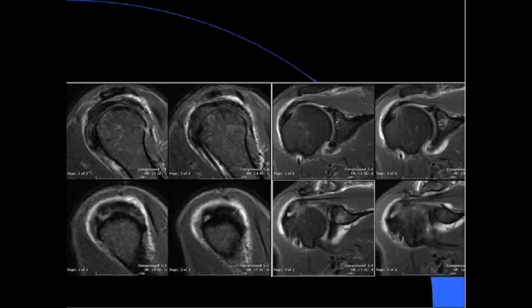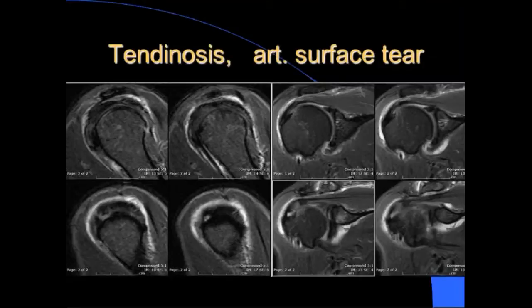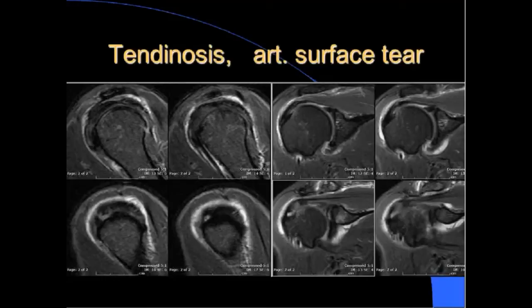Intermediate signal in the supraspinatus tells you it is not completely normal - we call that tendinosis or tendinopathy. As radiologists, we don't want to use the term tendinitis, which implies inflammation - that's a clinical term. Under the microscope, these tendons have no inflammatory cells. This is a process of aging: myxoid degeneration and fibrosis produce intermediate signal, seen in most patients over 40 to 50.